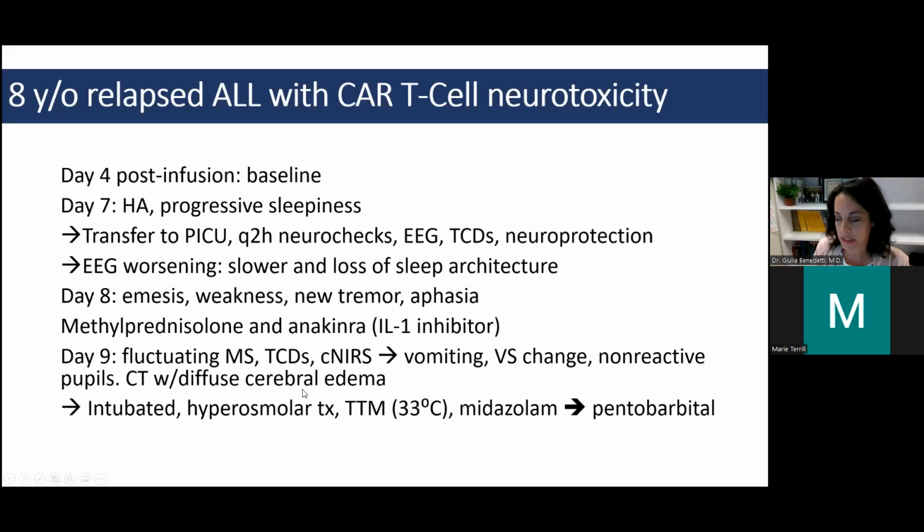CT showed diffuse edema. He was treated with targeted temperature management. We tried to suppress his brain activity with midazolam to decrease metabolic demand. That didn't work, so we did pentobarbital. I'll just walk you through his EEGs.